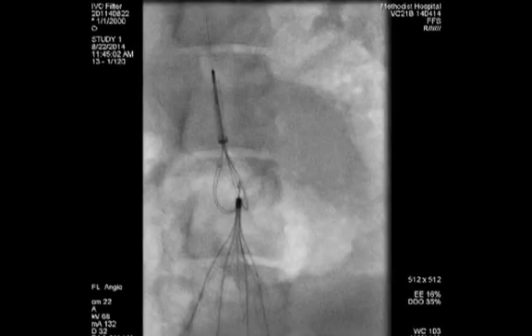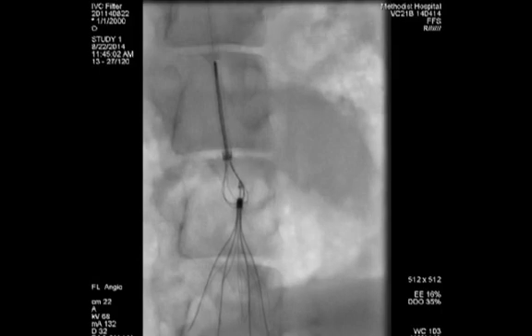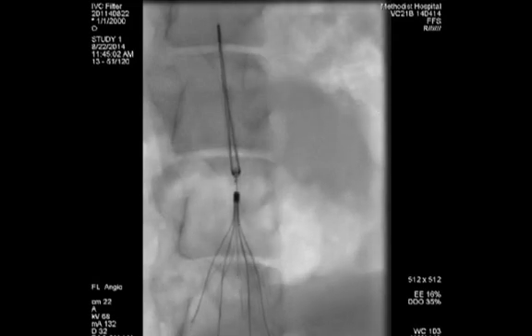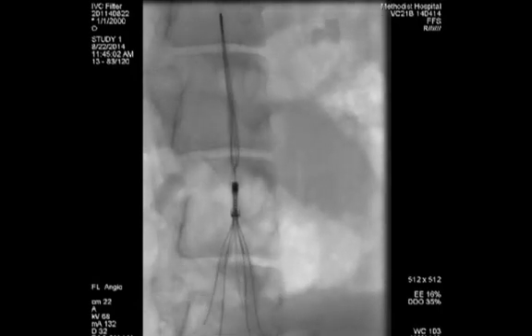This is a fairly straightforward filter retrieval situation. However, we can actually steer the snare around inside the inferior vena cava, and that is the real advantage to potentially using robotic techniques. It is still somewhat in its infancy and not many places have availability, but it gives a level of control when doing endovascular procedures that really can't be achieved in any other fashion.